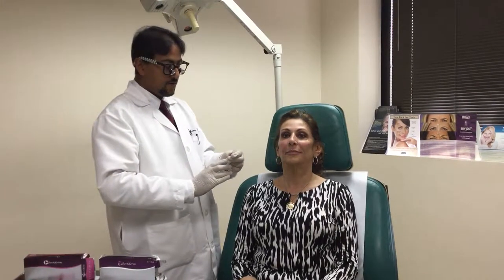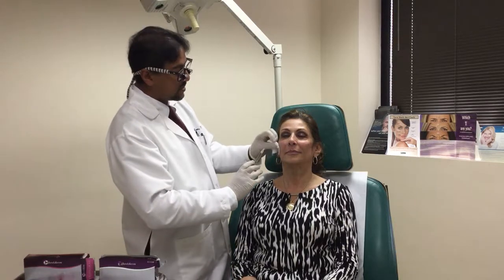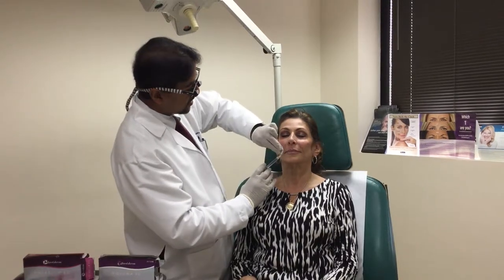So that's the Voluma. Next we're going to go to the Volbella. There are a lot of different filler products out there — these are both hyaluronic acid fillers, and they just have a slightly different cross-linking and slightly different characteristics.